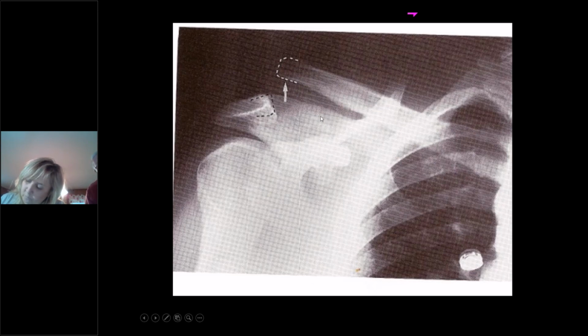In cases that are not as severe, sometimes this thing could just ride up a few millimeters, and they can have a lot of pain over it. So maybe they've got a grade 1 AC separation, or even a grade 2. There are some things like that that can be described. So when you see those kinds of things, they can certainly be there without having this full thickness separation. So basically, you still treat it the same way.